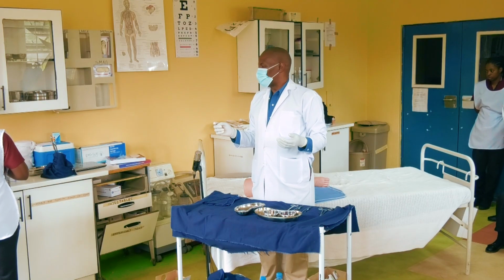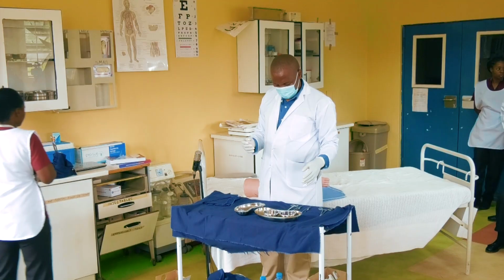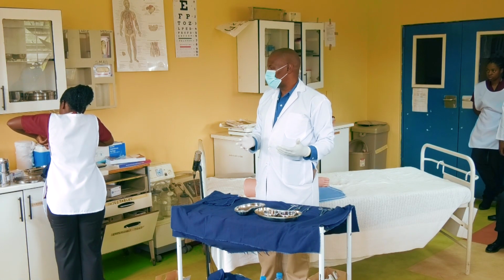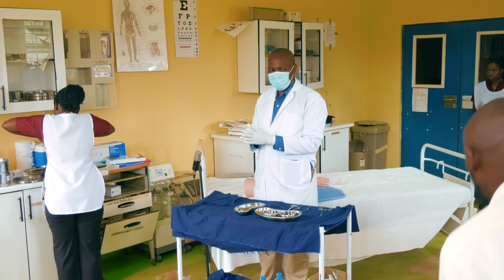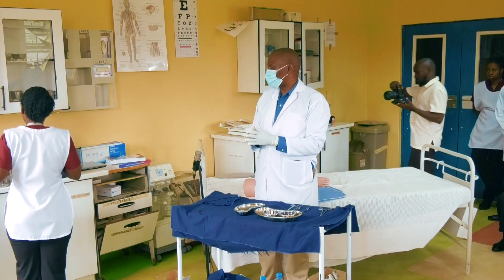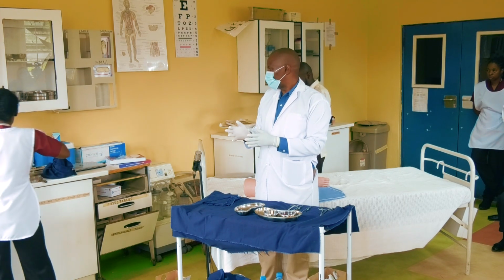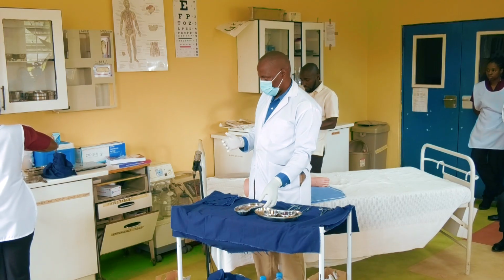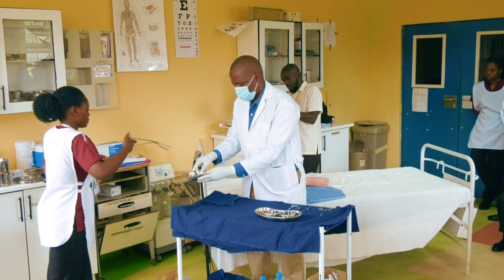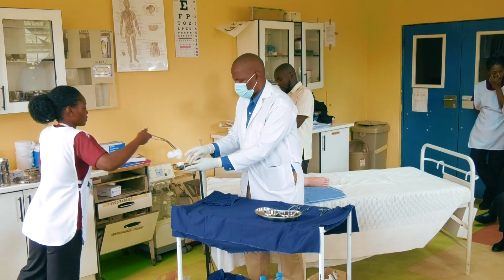Okay. Open it. Get the strips. Procedurally, please. Get two. You should be proficient by now. Move fast. Both of them? You can put one back, the one you're not using. Then get the swabs. Bring them so I can receive them. Okay.